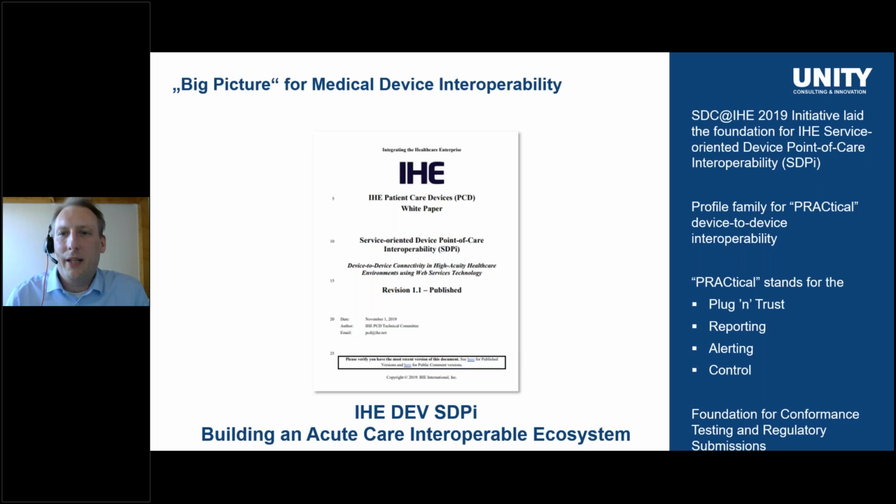We learned already that there is the IEEE 11073 SDC standards family, and that it is complementing the interoperability landscape that already includes HL7 FHIR, for example. So why do we need something else under the umbrella of IHE? Well, from my perspective, the IEEE specifications are very technical and address more the manufacturer side. In contrast to this, IHE typically also addresses healthcare organizations and explains the use of the technology in clinical use cases, which also makes the documentation more readable for this audience.